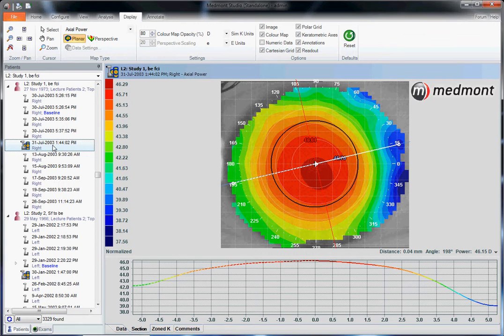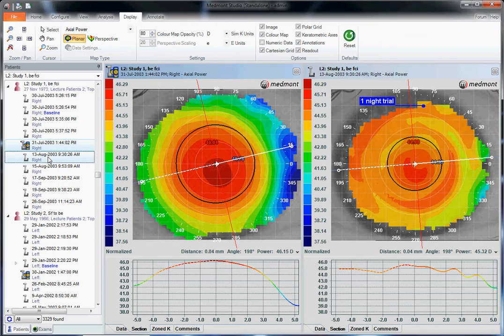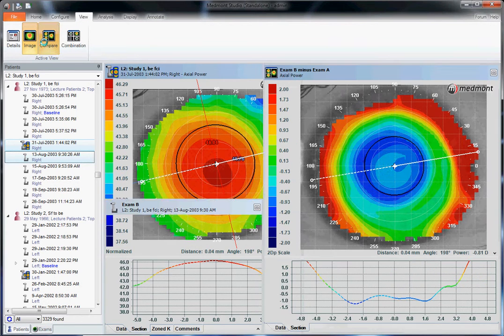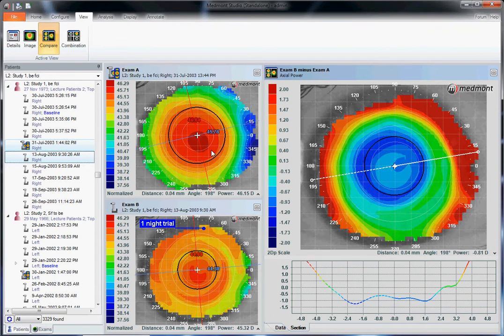Once you've highlighted your best baseline or in this case the composite, then we hold down the control key on the keyboard and click on our post-treatment topography. Now we have baseline or pre-ortho-K and post-ortho-K topography, one night in treatment. Then we go up to view and compare. This brings up the comparison map, subtractive map, or difference map.